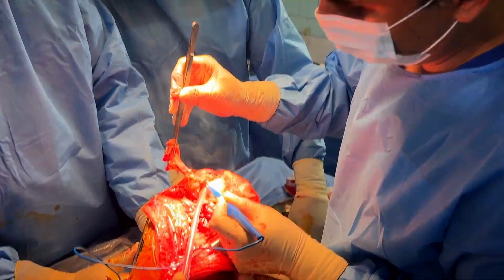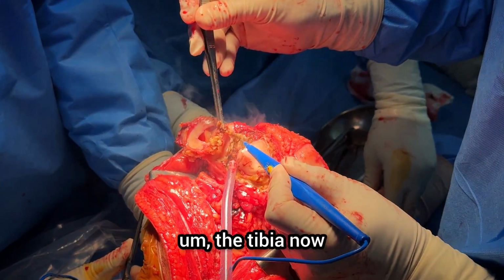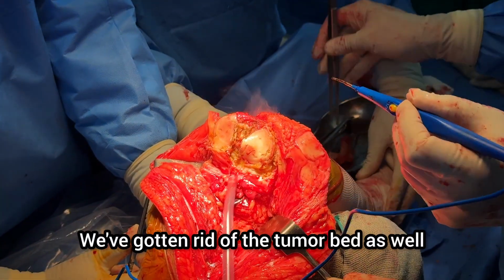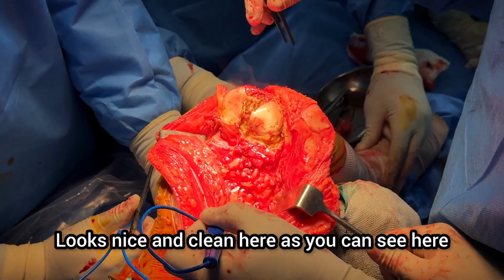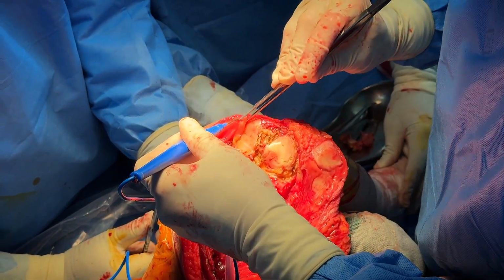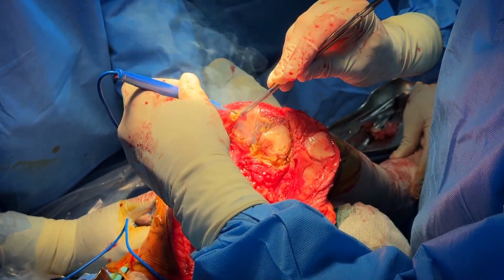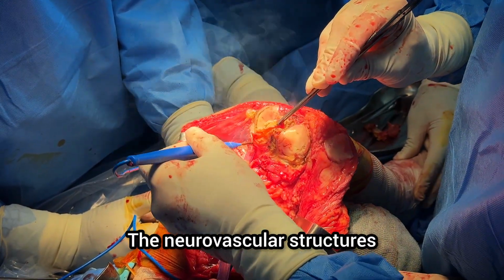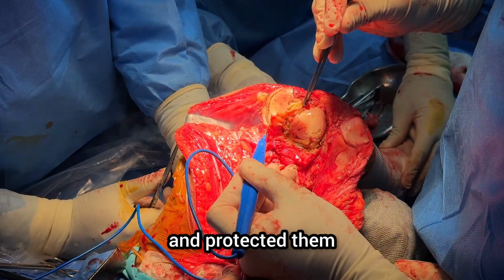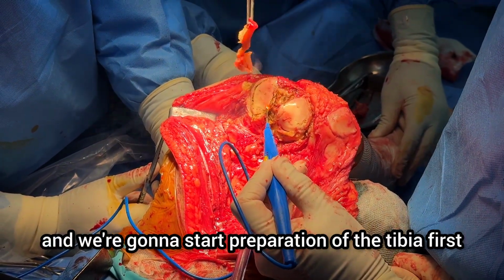We're in the process of preparing the tibia now. We've gotten rid of the tumor bed as well. Looks nice and clean here, as you can see. We do a final check right before we do the primary preparations, but it looks very nice and clean. So the bed has been removed. The neurovascular structures, we've identified where they are and protected them. So I'm getting rid of all the soft tissues so we can start preparation of the tibia first.